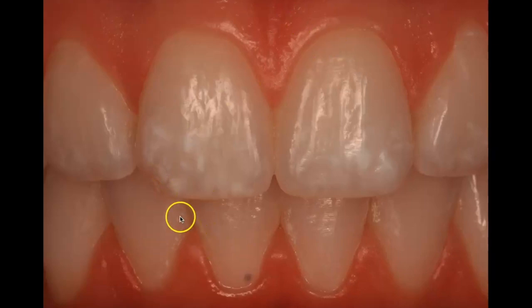but basically, whether it's orthodontic type white spots, decal on the gingival margins, or in a case like this, more like a developmental hypocalcification, and these types of cases, I would say that it's the least predictable in. But you can see she also had a little bit of decal here on this incisal edge, which we'll see more later.